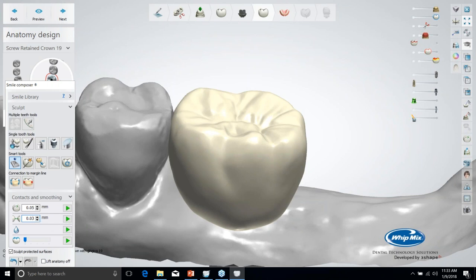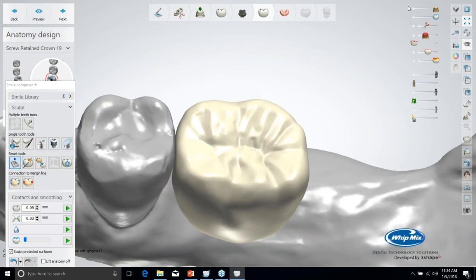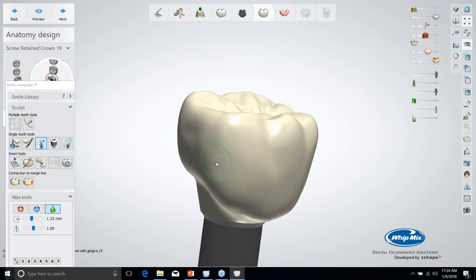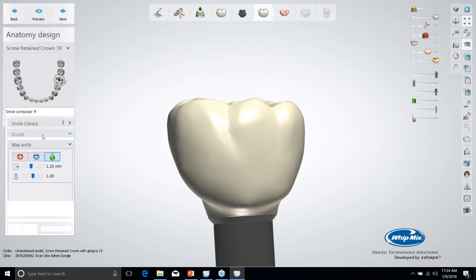With zirconia, usually you're going to be cutting your contacts out of contact a little bit because you'll be staining and glazing. And figuring out how much that is going to take a couple of trial runs. But usually it's going to be in the 20 to 50 micron range, but it'll depend on the glaze you're using and also the technique for applying it. So after we've cut it, I'm going to fix it around that contour just a little bit. Around that contact, just smooth out so we don't have a dimple. All right, so now we're done with the crown design, and we will be moving on to adding the tissue.